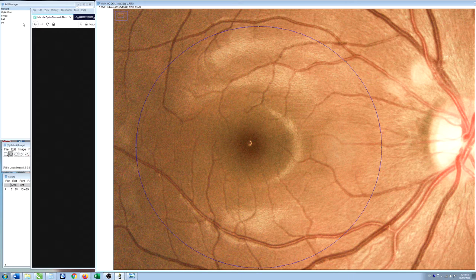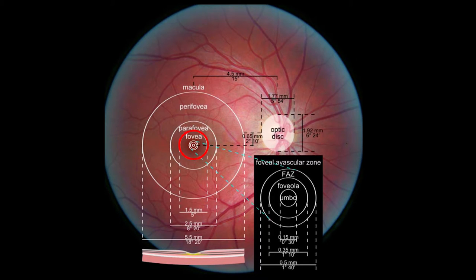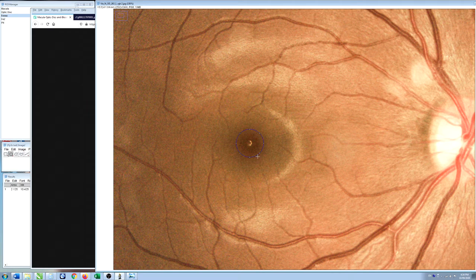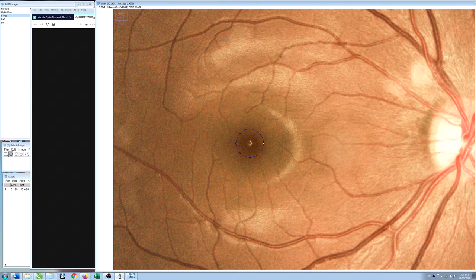Inside the macula you have the fovea itself, which in humans is about 1.5 millimeters in diameter — this darker area in the center of the macula. The reason it's darker is that all the overlying tissue gets pushed aside from the fovea. Looking at a side-view image, you can see all the overlying tissue has been pushed to the side into this central pit, making the pigmented epithelium behind the retina a little more visible and the area slightly darker.